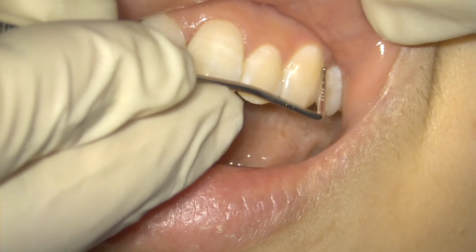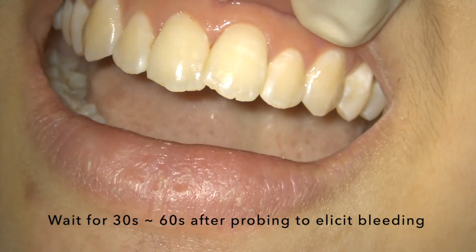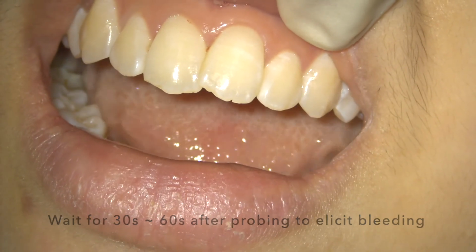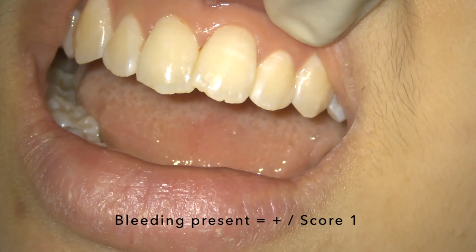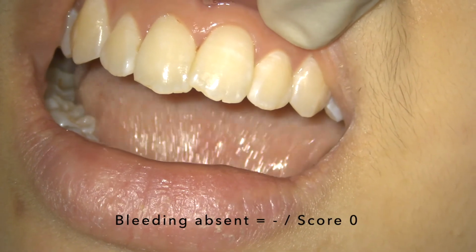You can wait up to 30 seconds, even up to 60 seconds sometimes, in order to elicit whether the bleeding comes or not, or whether the bleeding point is seen or not. If there is bleeding present, you can record it as positive, or you can put a score of 1. If there is no bleeding, then it will be a score of 0.